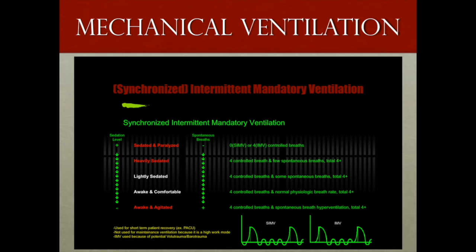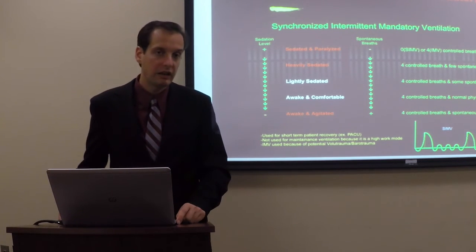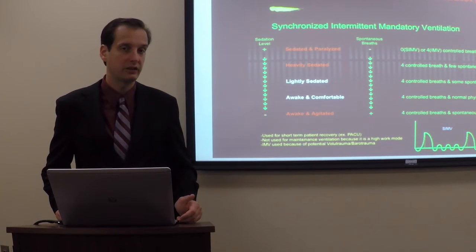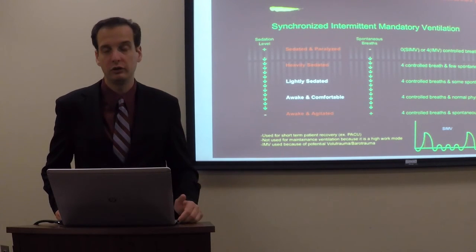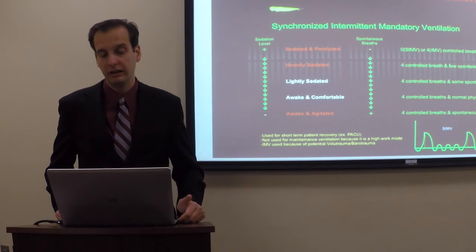And traditionally, a cardiac surgeon would come out with a first case, put them on the SIMV of 10, and say decrease the intermittent rate by 1 breath every 15 minutes as the patient wakes up. And then at the end of their second case, they would come back to the ICU, check on them. They'd be on an SIMV of between 2 or 4 and breathing spontaneously in between and ready to extubate.